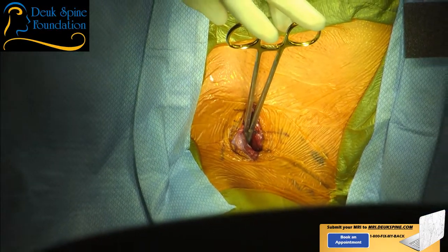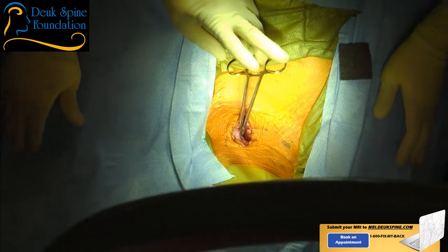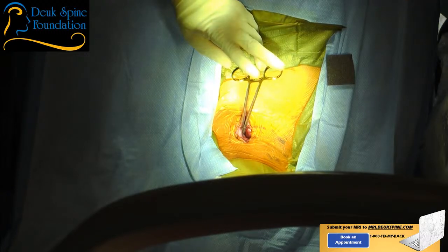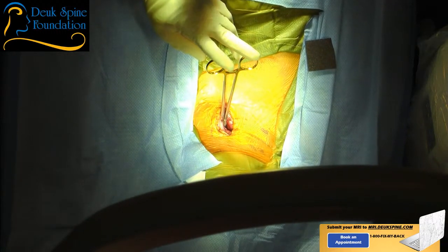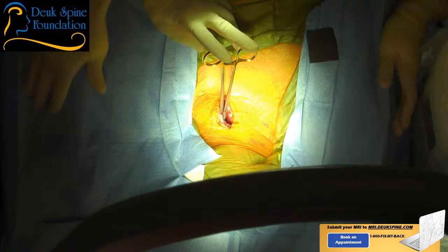Table up, please. I'll need a shoulder pull. Stay away from the sterile table. Take your time. Let's get the table up. All right, let's see if I can answer a question while we're putting the patient in position to get an x-ray. I don't think it's high enough.